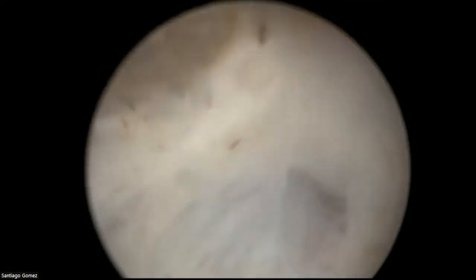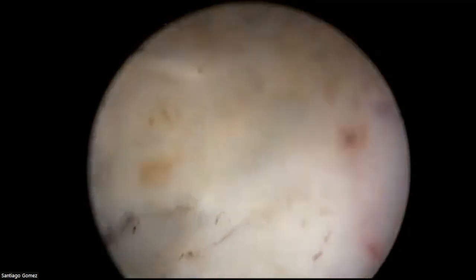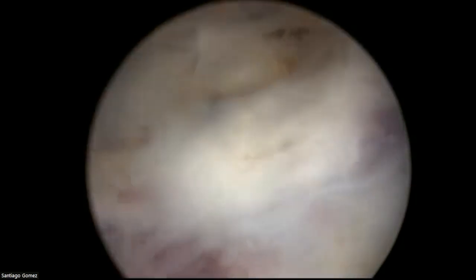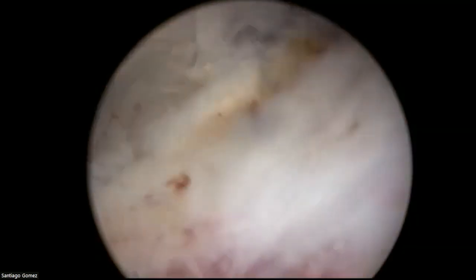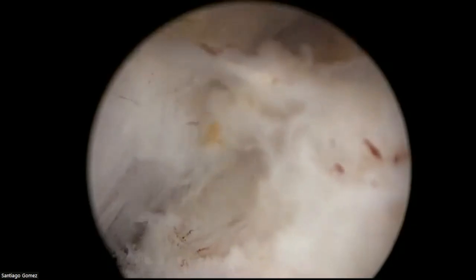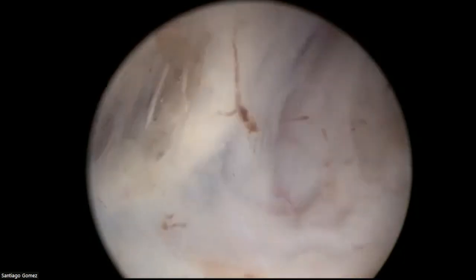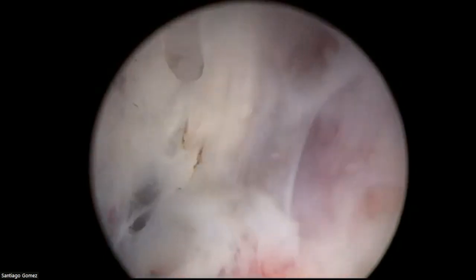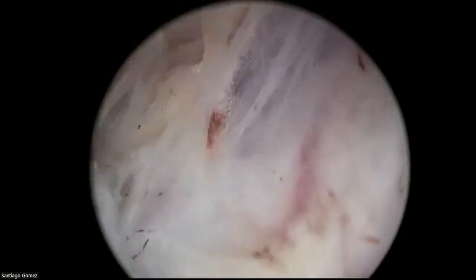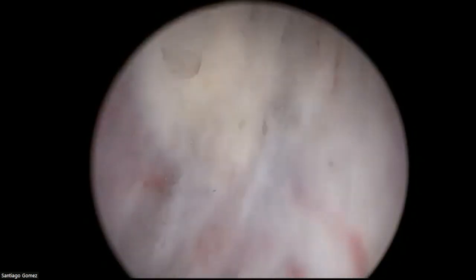Sometimes you could see a very nice posterior plane. And then in that same patient, maybe the anterior plane is not so patent. And the other way around, sometimes you don't see a very good posterior plane and you see an excellent anterior plane. So that's why you have to start recognizing the plane, not because it's beautiful, especially with these lasers that coagulate so much, and so good, like thulium fiber and so on. If you have a view of the beautiful plane, when you fire the laser, it's going to coagulate. It gets white, so you no longer see the plane. I mean, you see the plane, but not very beautiful like before.